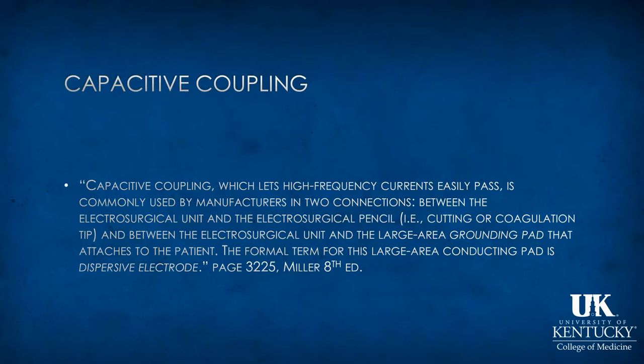Now, let's move on to something called capacitive coupling. This is something that I only became aware of recently, although I'm sure it's been in existence for a long time. The definition of capacitive coupling is a condition that allows high frequency currents to pass easily and is commonly used by manufacturers in electrosurgical units.